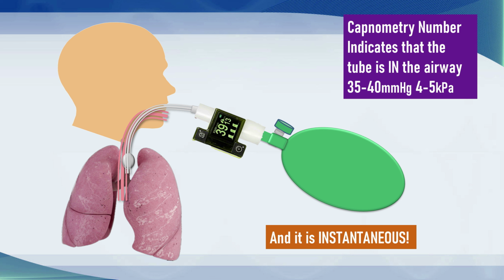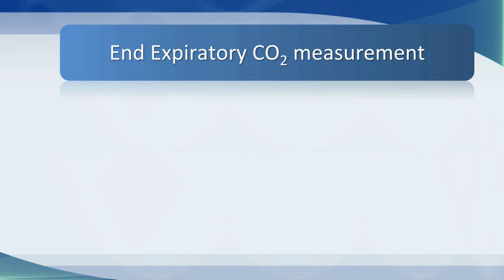Every anesthesiologist will tell you that the standard sidestream gas analyzer, and we'll talk about this a little bit later on, incurs a delay, and time just seems to stand still waiting for the waveform display. This will be instantaneous. It just gives you a number straight away. So these are terrific, and earlier versions of these were used, connected to a big monitor back in the day, and these are available and they were very popular during the COVID pandemic.